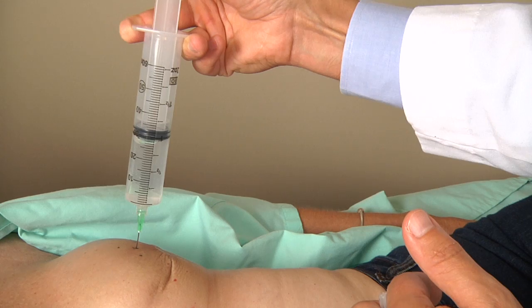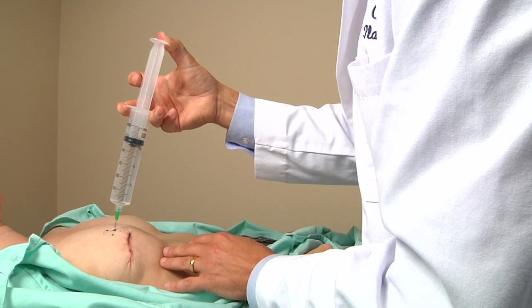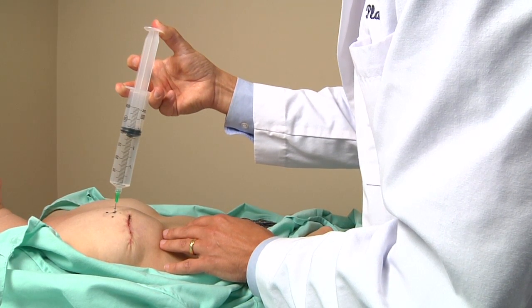If a seroma is present it can be aspirated after injection while the needle is being withdrawn. The amount of filling would typically be in the 50 to 70 cc range, but could be as low as 30 cc if the skin is tight and uncomfortable, or over 100 cc if things are going more easily. Filling continues until the patient says it is becoming uncomfortable or the skin begins to blanch. Excessive erythema, edema, pain, or tenderness would be a reason to stop further filling.